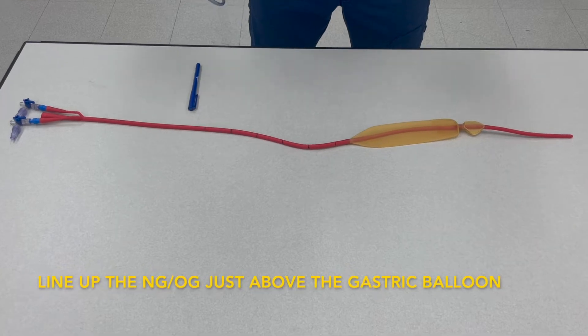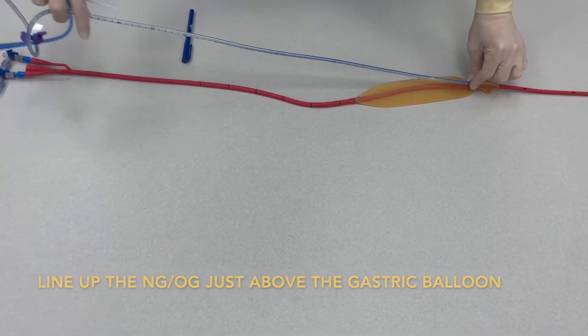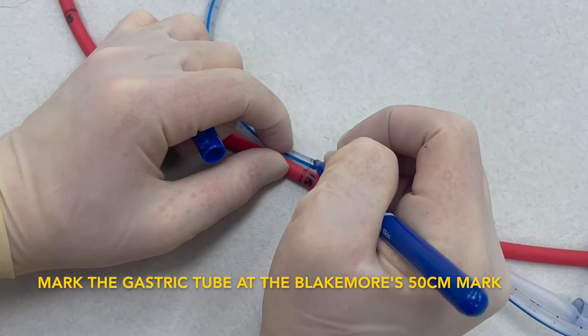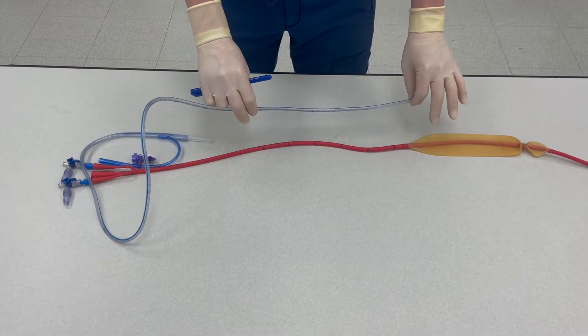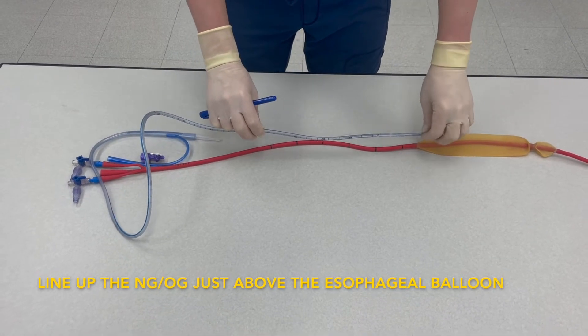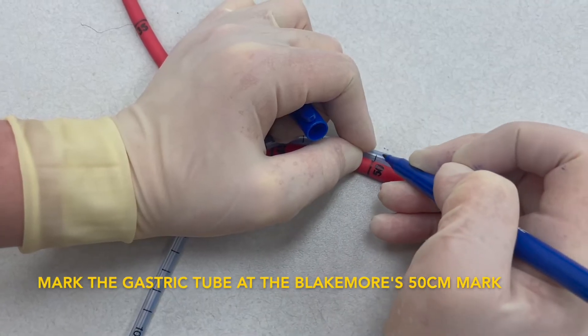Line up the distal tip of the gastric tube next to the Blakemore just above the gastric balloon. Take your marking pen and write the number one at the 50 centimeter mark. Again, line up the distal tip of the gastric tube next to the Blakemore, this time just above the esophageal balloon, and write the number two at the 50 centimeter mark.